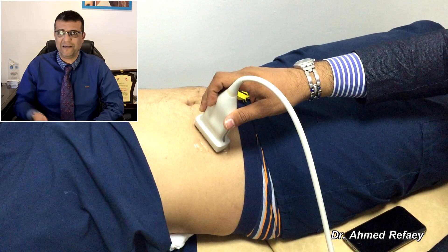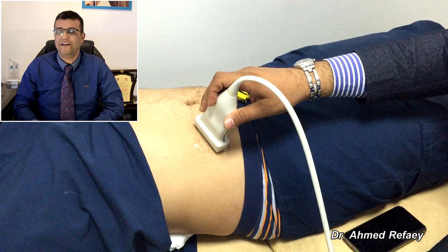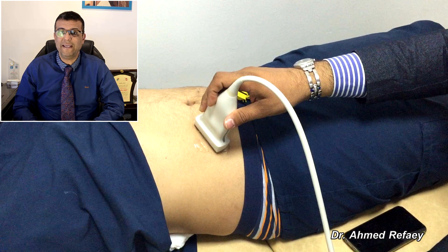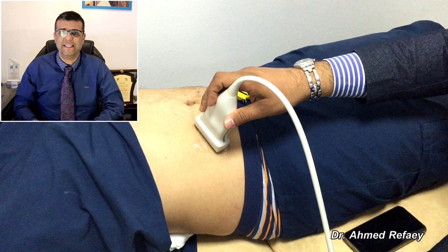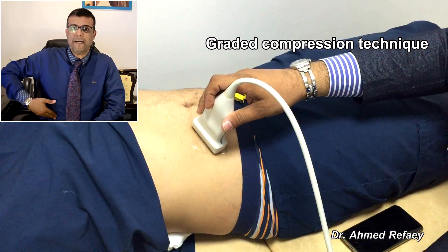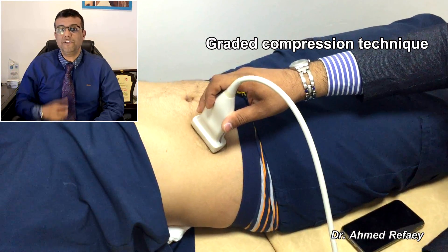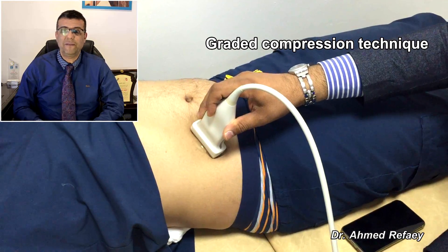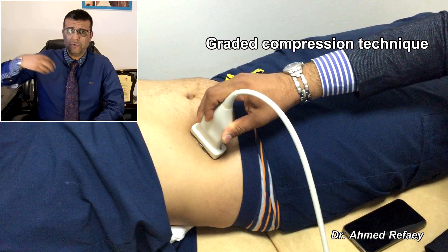Start to speak with your patient in a friendly way about anything away from their current condition — like hobbies, favorite food, sports, or favorite football player. During that, apply some pressure with the probe step by step. If you apply sudden pressure, the patient will express severe abdominal pain and will guard their abdominal muscles, making the examination very difficult.